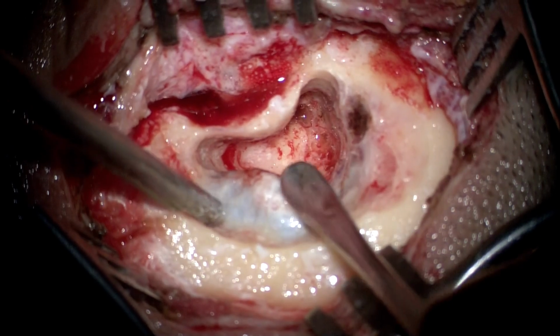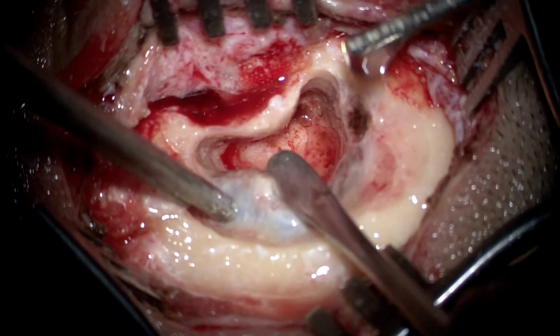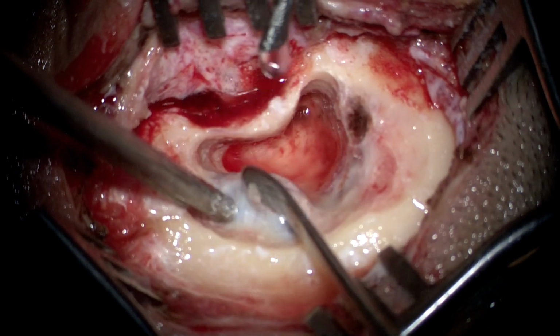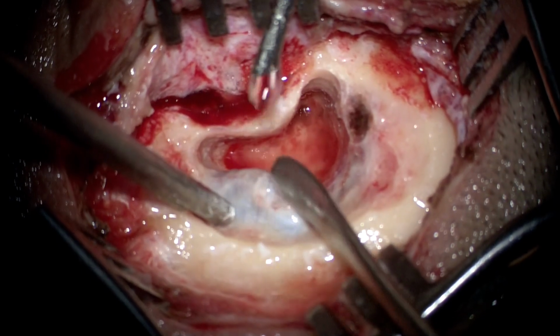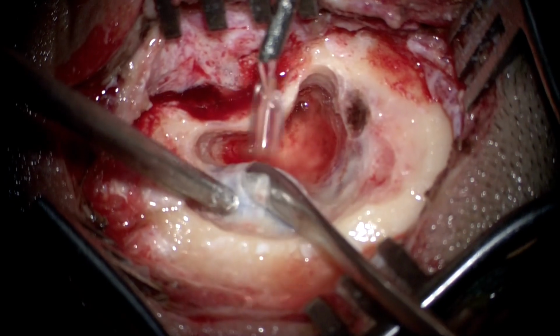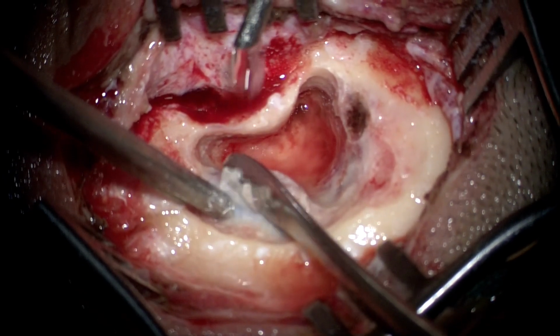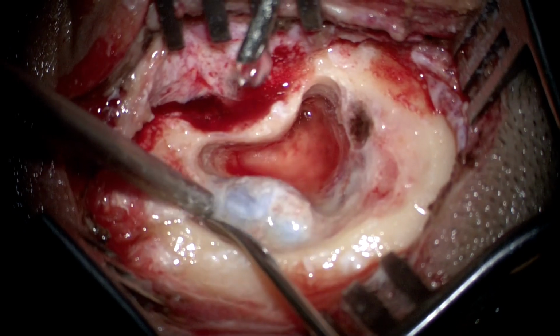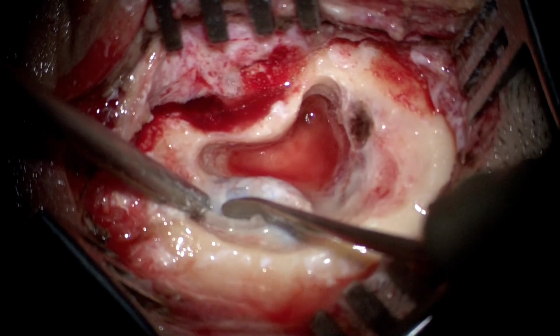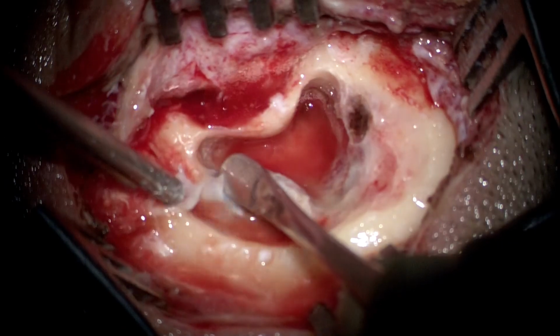So now we resort to a Freer's or a broad septal elevator to remove the last thin eggshell bone over the sigmoid sinus, as seen here. And this step also again is done constantly under irrigation, because the slight amount of bleed, if one sees, can be washed away, and thus the vision is not compromised and we can proceed with the surgery.